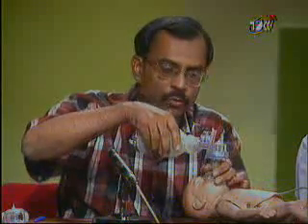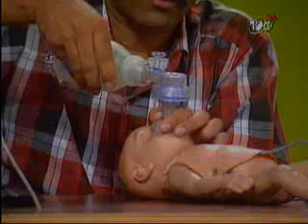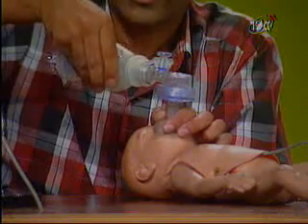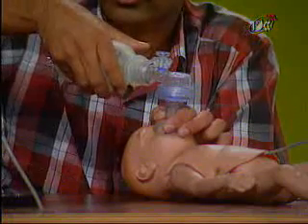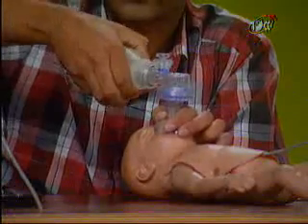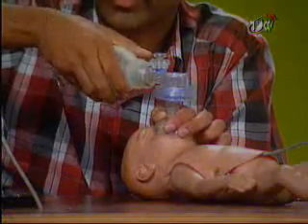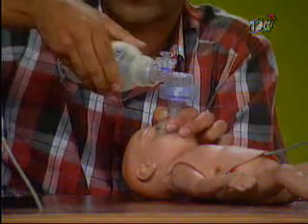The amount of pressure you are going to use should be just enough to cause the chest to rise. Watch carefully — you can see the chest of the baby gently expanding when you compress. Kindly ensure that you are not emptying the entire bag, as many people try to do in a panic reaction. That is very dangerous because you can infuse high pressure into the baby and sometimes cause trauma. Just provide enough gentle pressure to cause the chest to inflate gently.